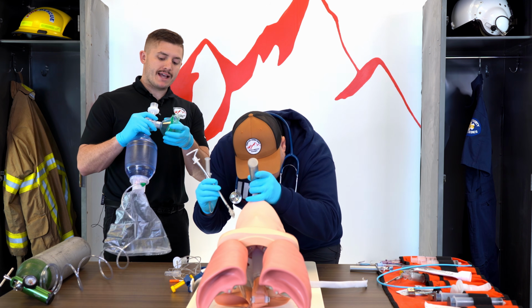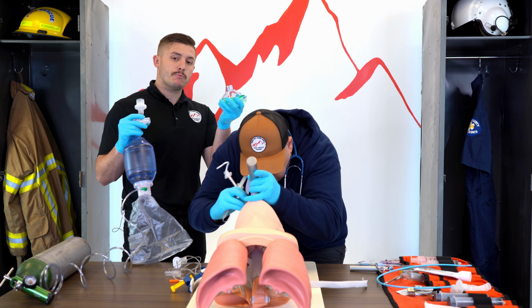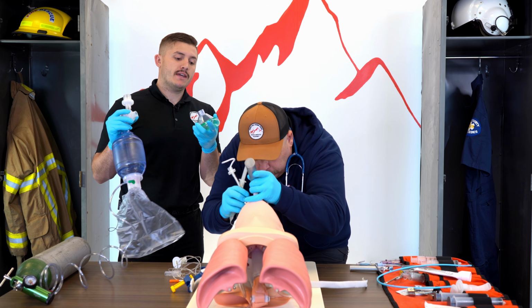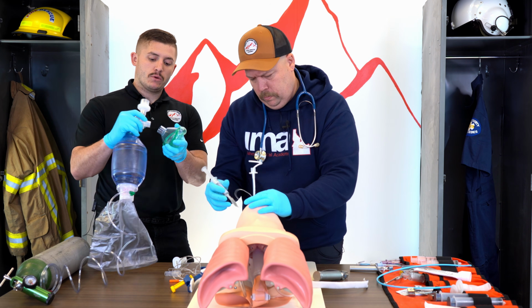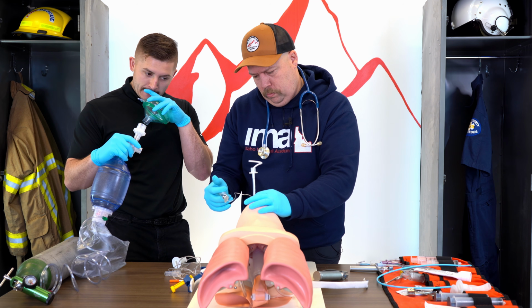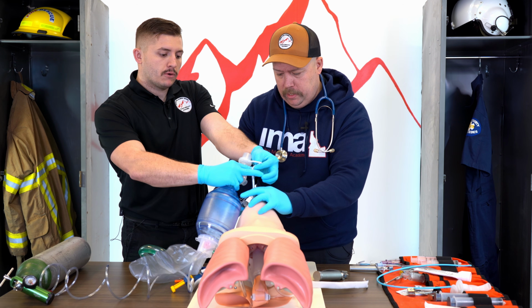Again, I'm taking the mask off, but I'm going to leave it in my hand. I have my NPA still in place. So if he misses the tube, I can quickly reattach this. Looks like he's got it. Go ahead and pull the stylet. Okay, I'm going to pull your stylet.